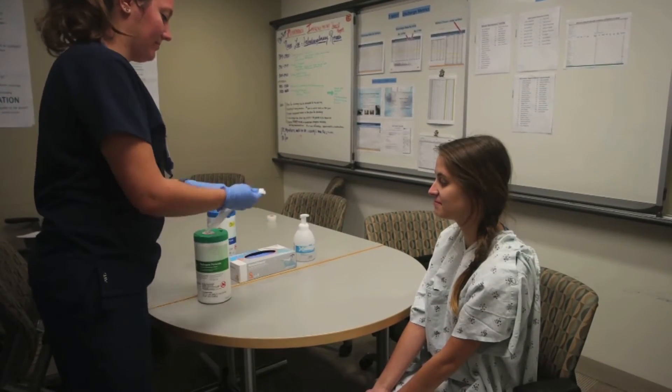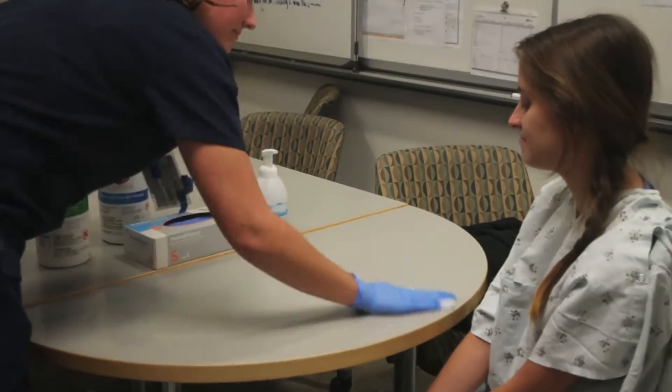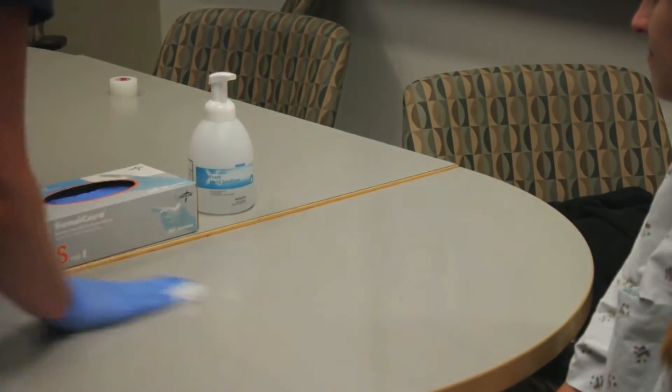First, clear your work surface and then wipe down with a disinfectant cloth and allow to dry. Remember to use a stable surface and not your patient's bed.